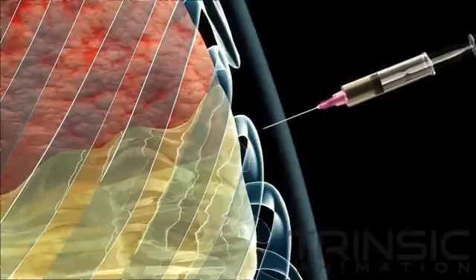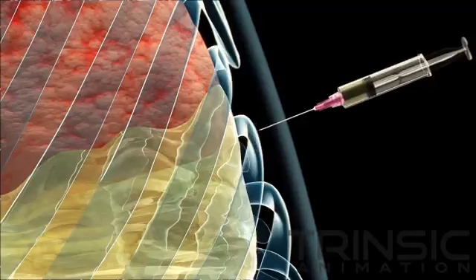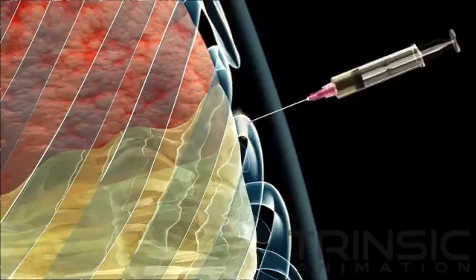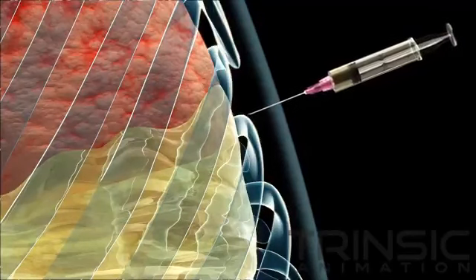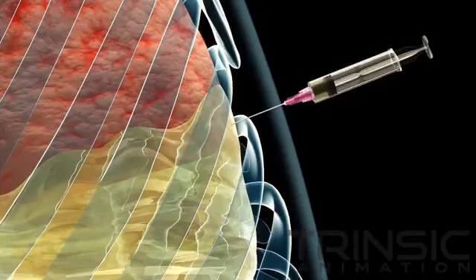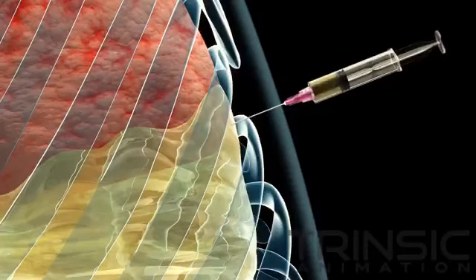Insert the needle above the rib to minimize manipulation or laceration of the vascular bundle located beneath the rib. As the needle advances, identify the pleural space by the presence of pleural fluid aspirate in the syringe.